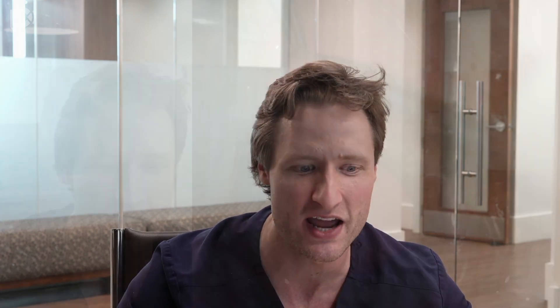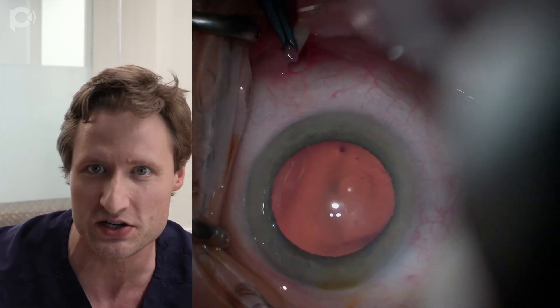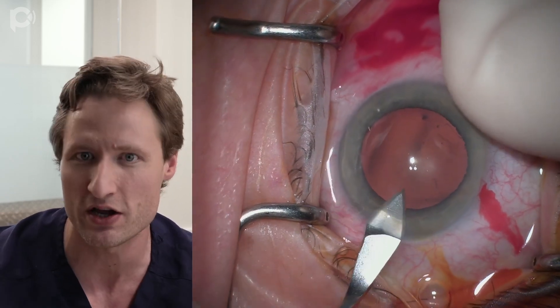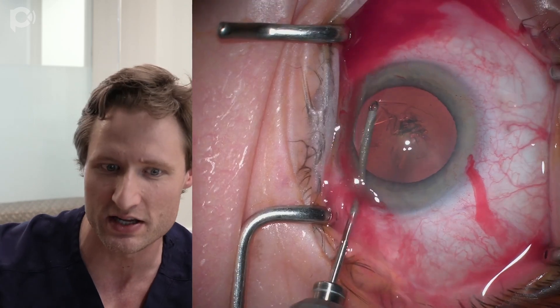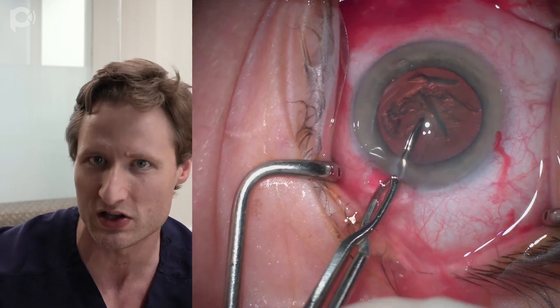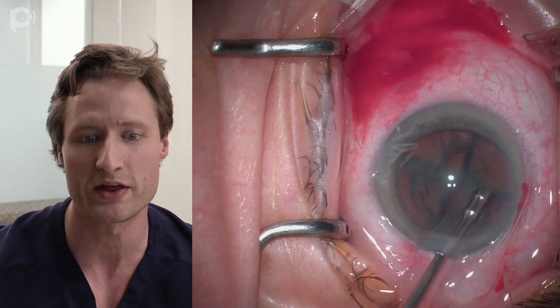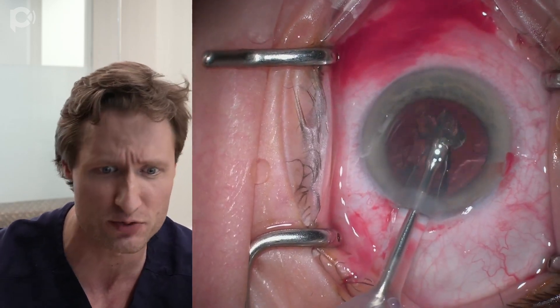I still experience cases like this myself, and I want to show you a case from just five days ago — a phaco-DMEK, a patient sent to me for cataract and Fuchs dystrophy. In this combined cataract surgery and DMEK, I'm using a 3.0 millimeter keratome for my main corneal incision. I'm putting cohesive viscoelastic in the eye — always cohesive for phaco-DMEK, so it won't interfere with graft unfolding or interpose between the graft and the posterior cornea and cause a detachment.